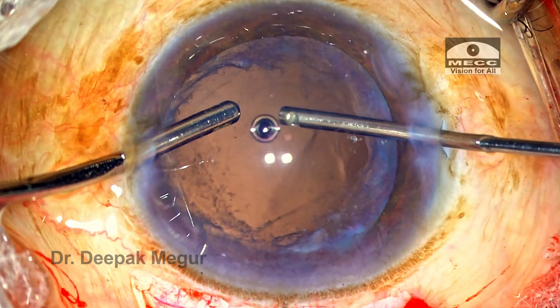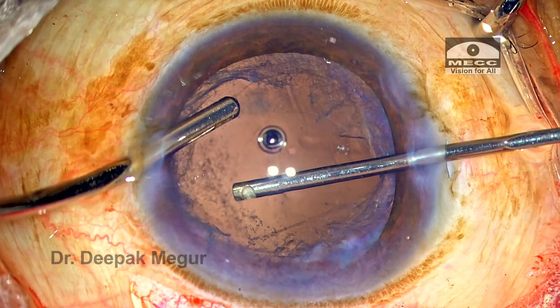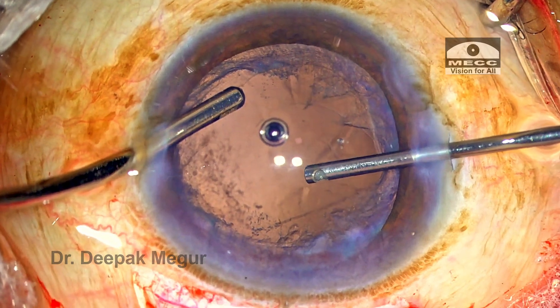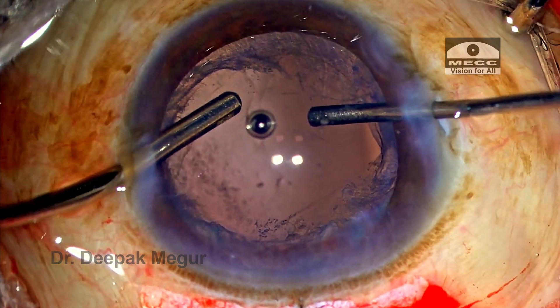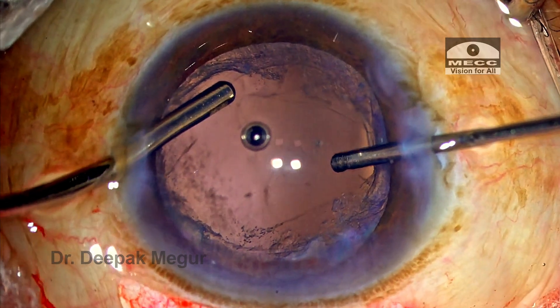Most beginner surgeons are very fearful of dealing with prolapsed vitreous. The one skill which is going to save them is knowing how to perform a good vitrectomy. And believe me, it's not very difficult. Just to get you out of this phobia, I've got this case.